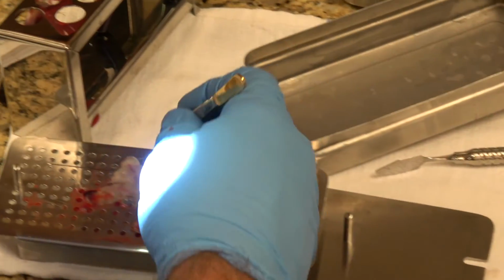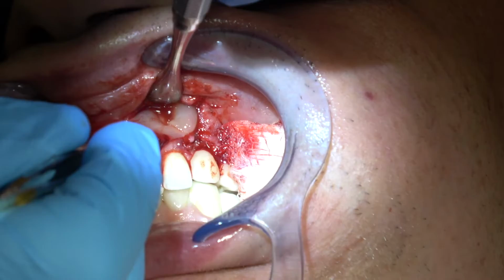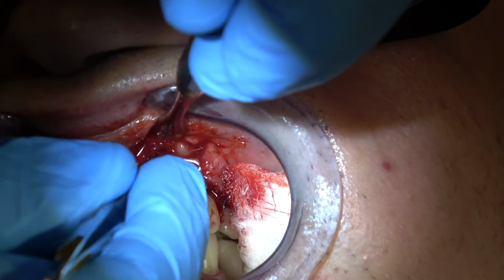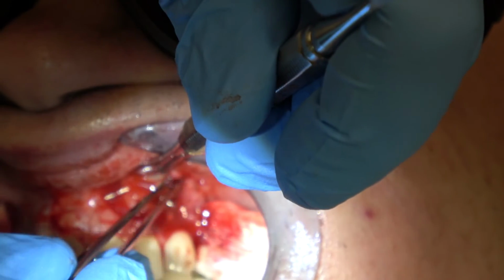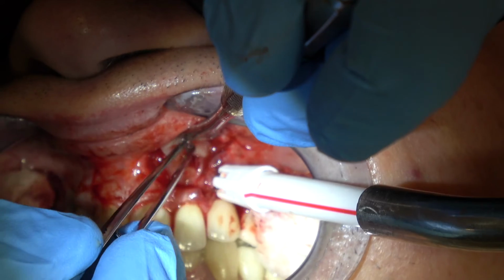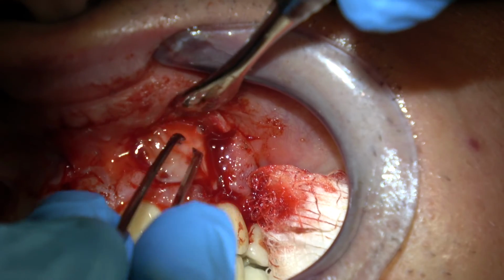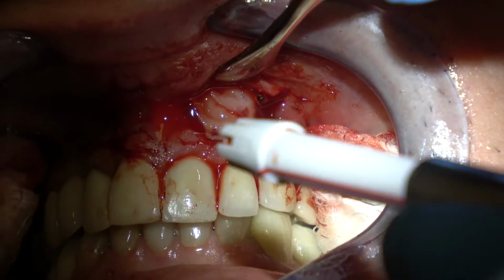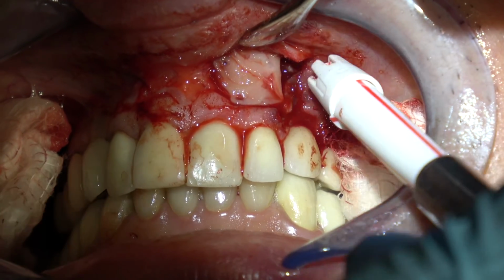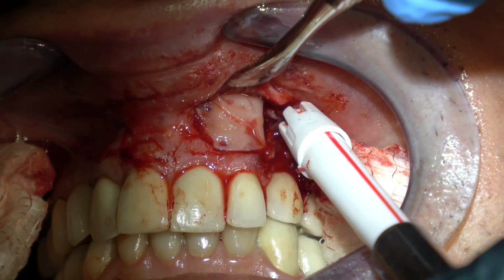Then here comes my platelet-rich fibrin membranes. Just pack that in there. You just feel the healing with all that growth factor. Just plug that in, and then we're going to put one flat right over the surface. You can put a resorbable collagen membrane over this if you want to, but it's not necessary.